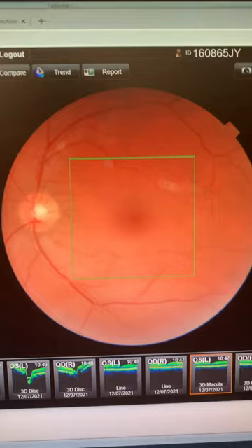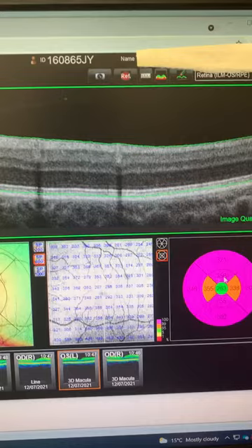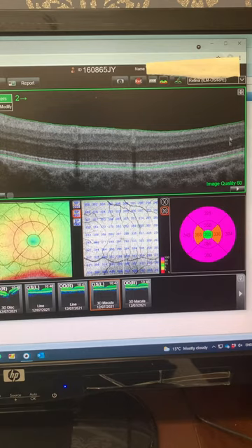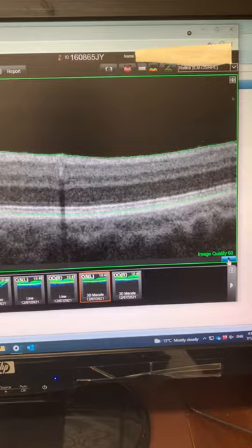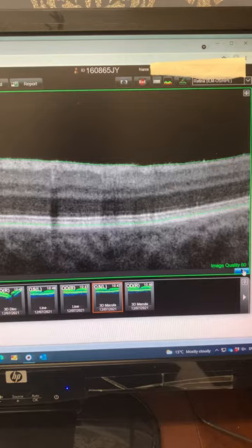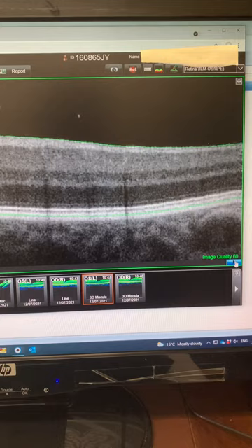If we go to this scan here — I'll come back a little bit, there's a post-it note for anonymity — all of these different stripy layers are the different layers of the retina. Playing through the video, everything looks really nice, smooth, and normal, all really neat, until we get to a point about a quarter away from the end.